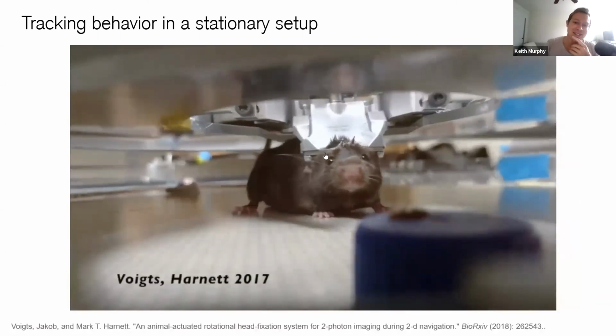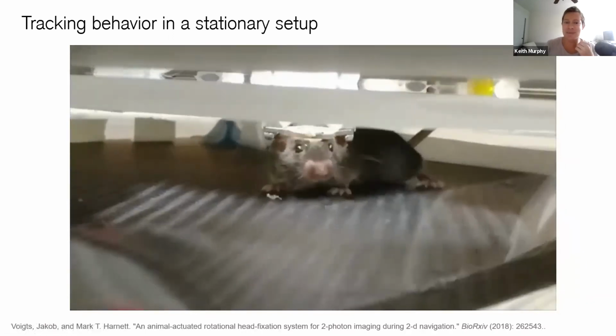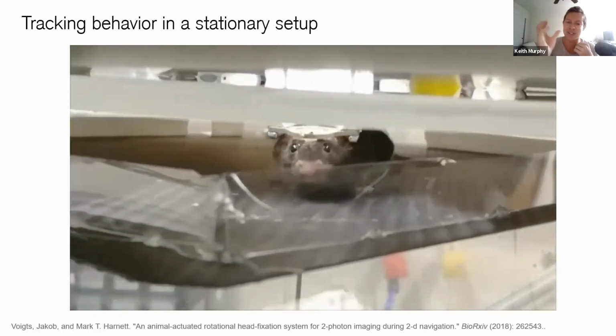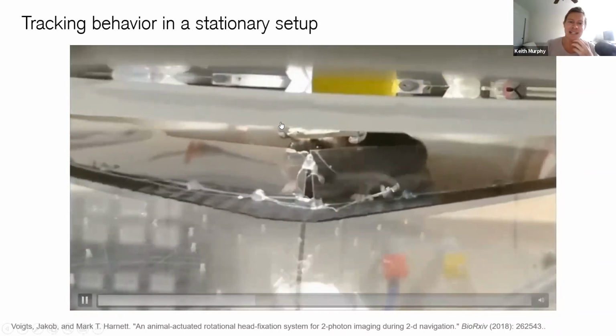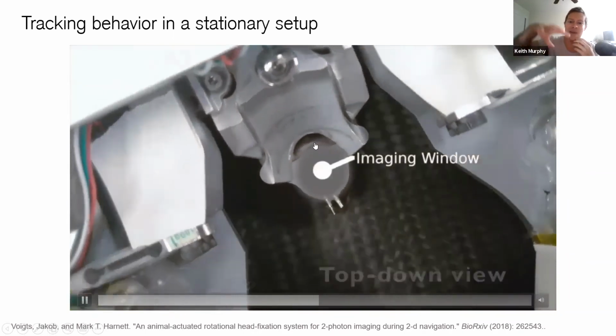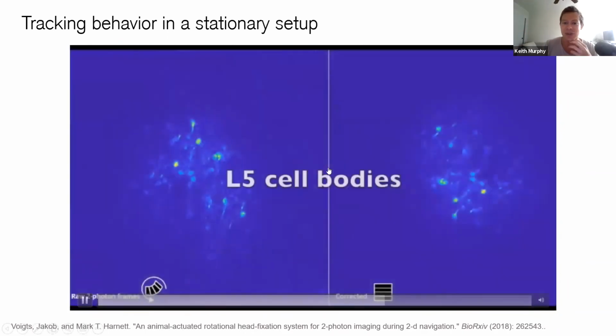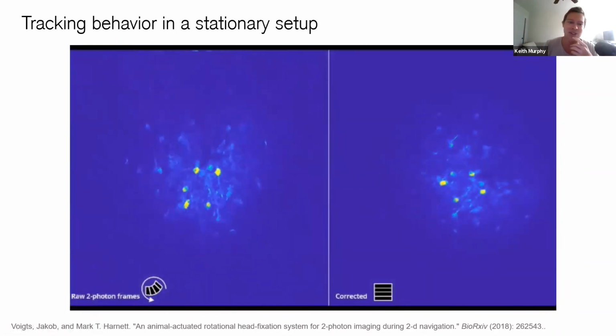And here's a cool thing. So people argue that there's too much tension when it's fixed, but this group actually sensed rotational force. I forget how they did that, using some sort of strain resistance measurement, and they would actually rotate the whole imaging apparatus to reduce that strain in real time using a closed loop algorithm.